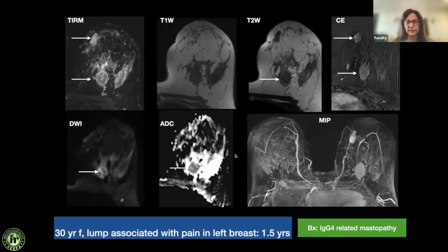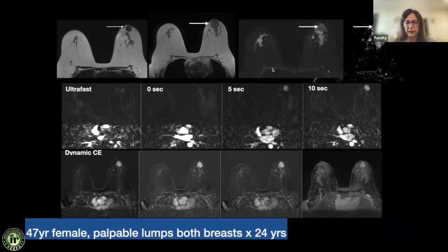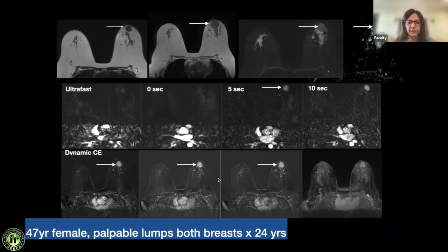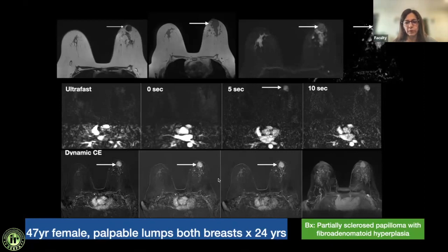Case 14: Another T2-low lesion, iso- to low on T1, with no restricted diffusion — unlike the IgG4 case. However, on ultra-fast imaging it enhanced within five seconds of contrast reaching the aorta, raising suspicion for malignancy and a BI-RADS 4 classification. On biopsy this was a partially sclerosing papilloma with fibroadenomatoid hyperplasia. This shows that ultra-fast imaging applies to classical malignancies — papillomas can mimic malignancies by enhancing early, while invasive lobular carcinomas enhance late.